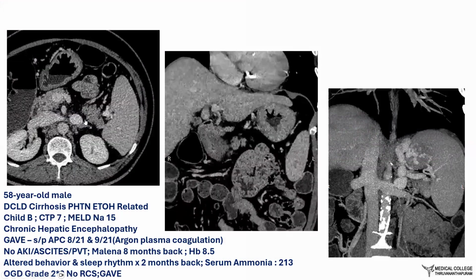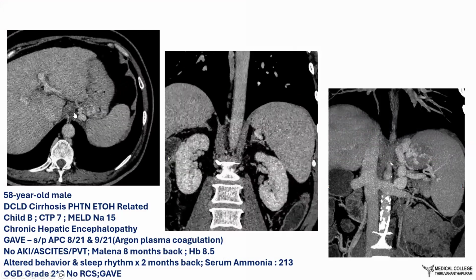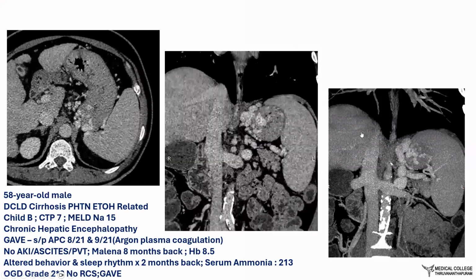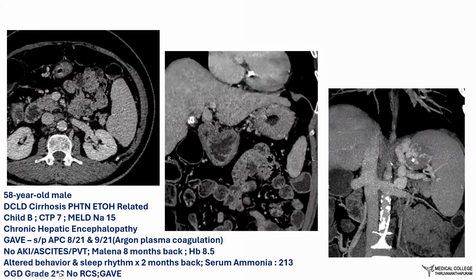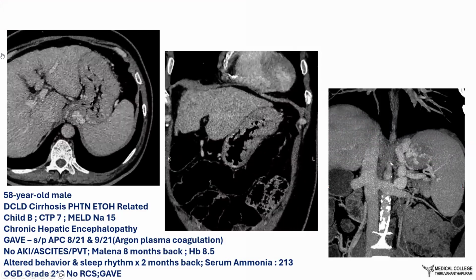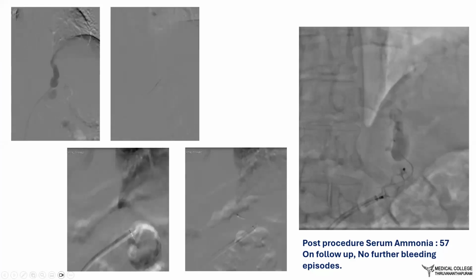Presently, the patient had evidence of hepatic encephalopathy, for which CT was done to look out for shunts. So we saw a gastrorenal shunt with multiple varices, but there was a large mucosal varice as well. At the time of our procedure, there was no recent evidence of any melena. So this case is just to highlight in practice what we are doing different from Chitra at present.